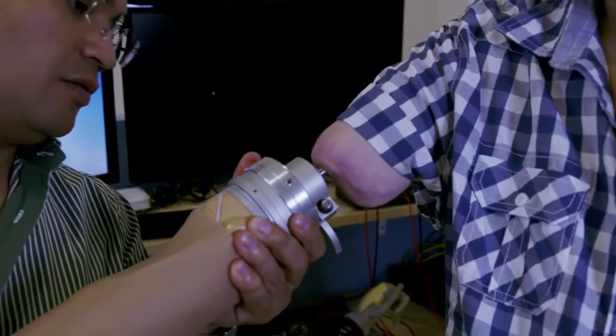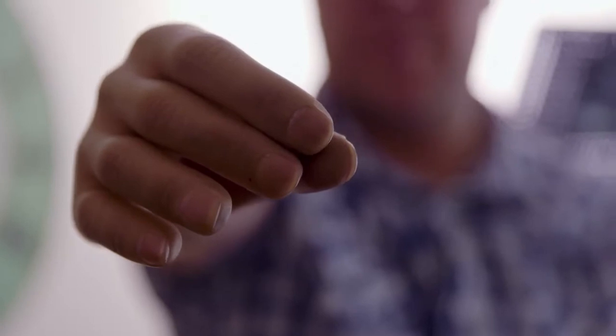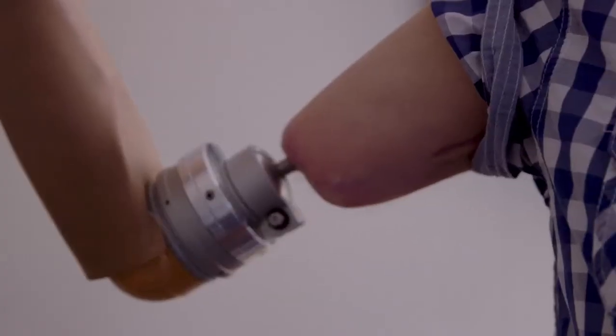The way this hand knows what to do is because Magnus is sending a signal from his brain, the nerves, to the electrodes that are implanted on his arm. And those signals travel through the implant to the hand and then the hand activates.